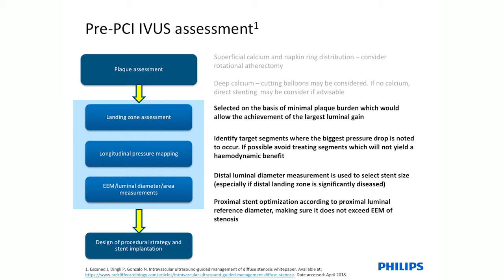This is a very typical situation when you have a chronic total occlusion, for example, where on many occasions you have remodeling, or as I mentioned before, you have certain pathologies like diabetes and renal patients where sometimes you have this process of negative remodeling that really complicates or makes it advisable not to be too aggressive in the selection of your stent. So it is something that really contributes to the safety of your decision making.